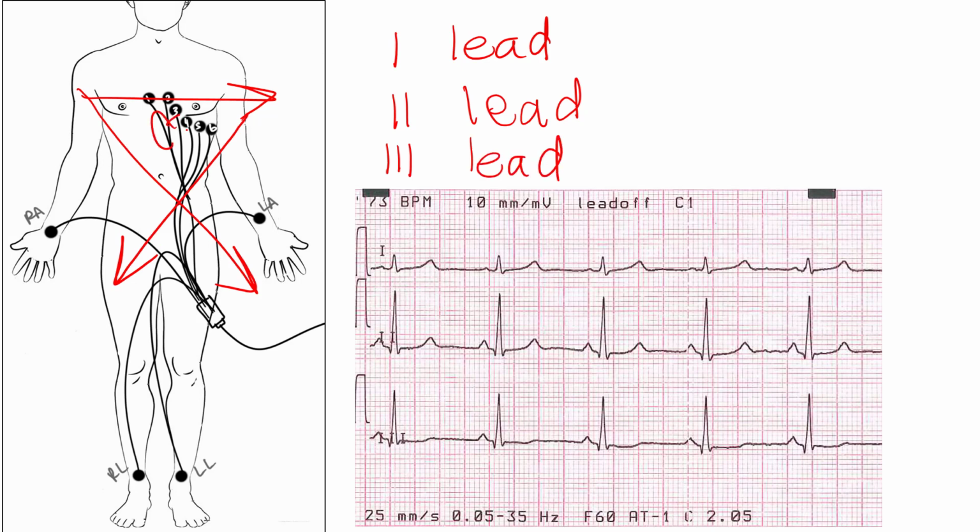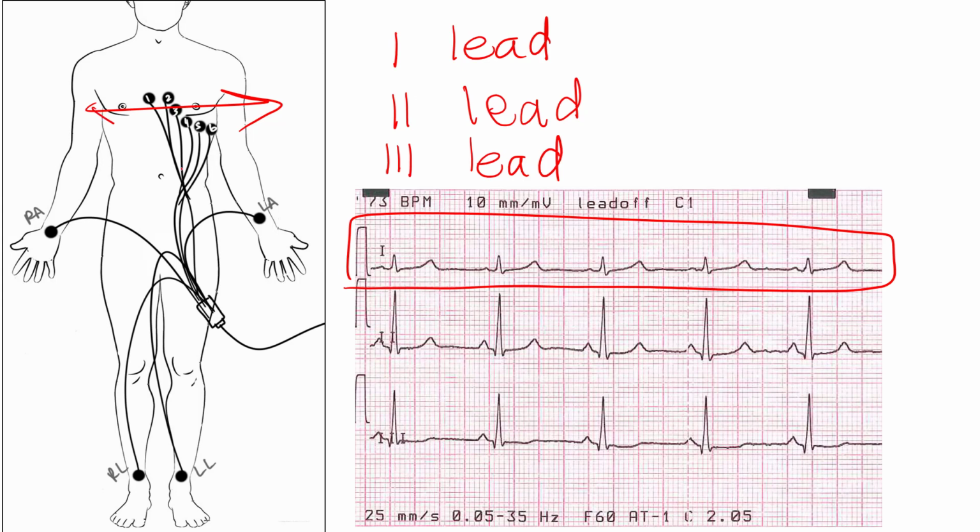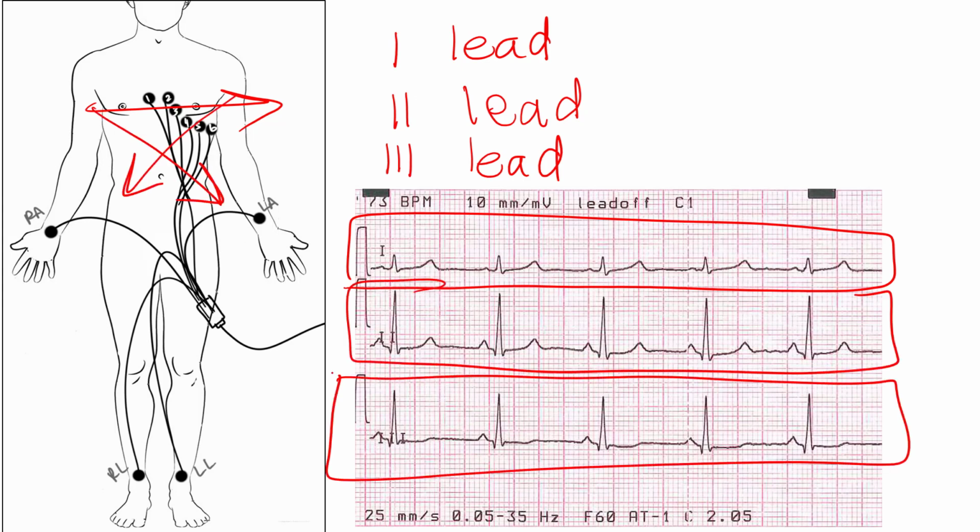And you might recognize that triangle there. That's basically Einthoven's triangle, which is these 3 famous leads, typical limb leads that we see. Since you're looking at the heart from 3 different computer views, it doesn't surprise you that the tracing or the recording looks slightly different on the electrocardiogram.